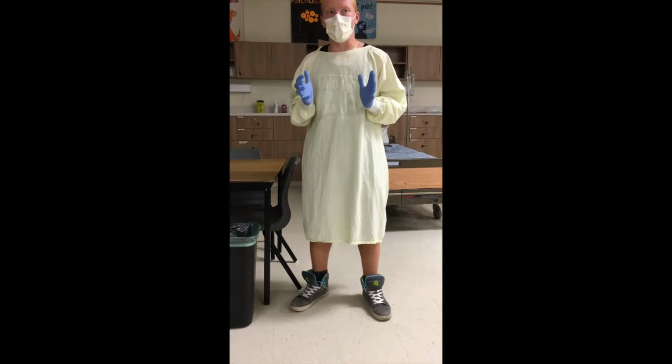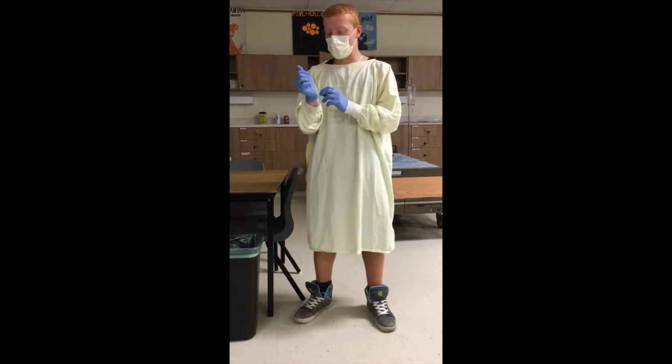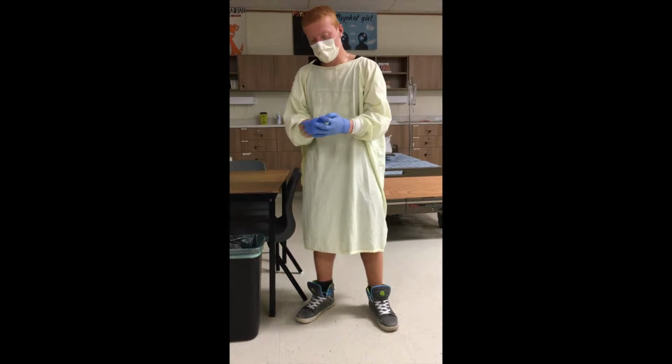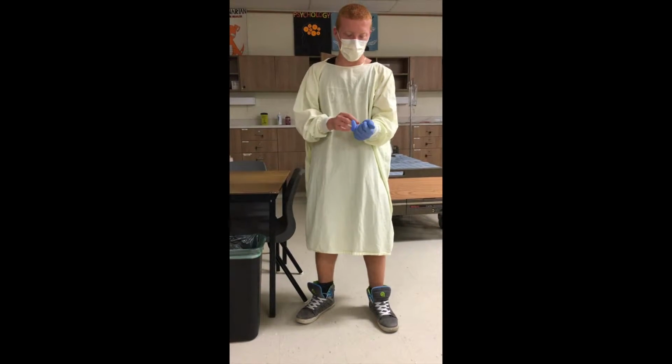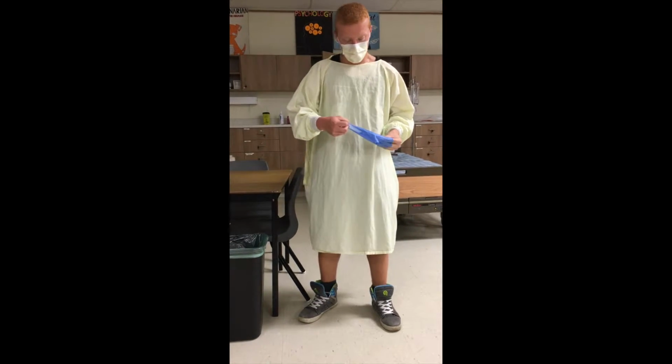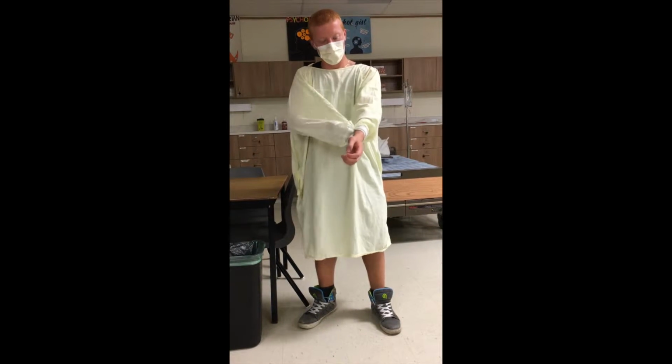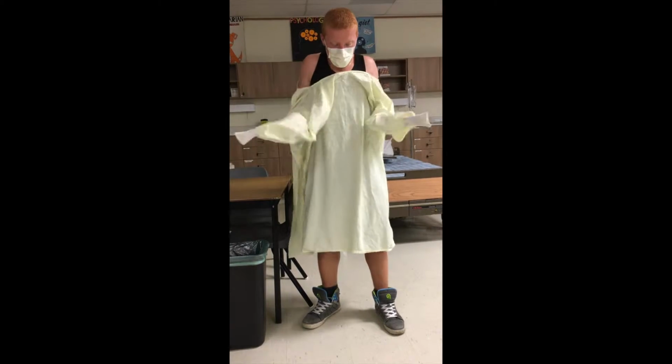Okay, so after you're done with the patient, you want to take off the most contaminated and work your way to the least contaminated. So first, you want to take off your gloves. One, ball it up in your fist. Take off the other one so it's just like a bag. Throw it out. Next, take off your gown.